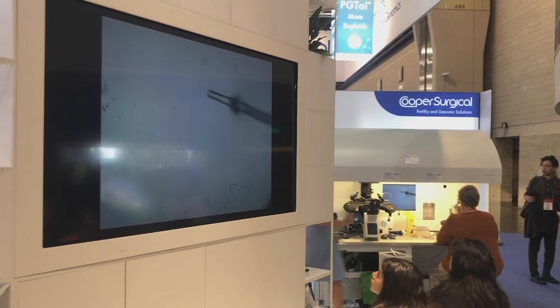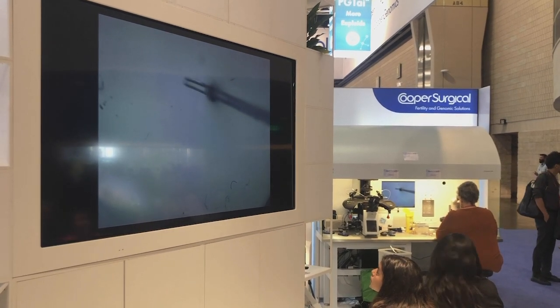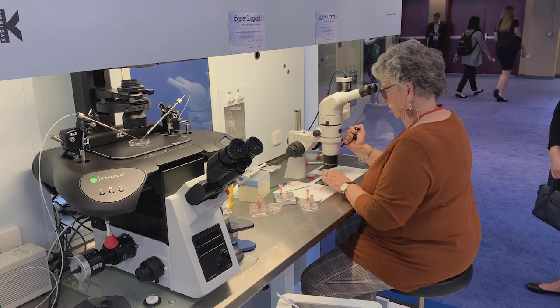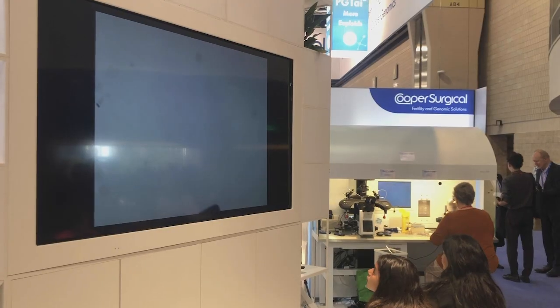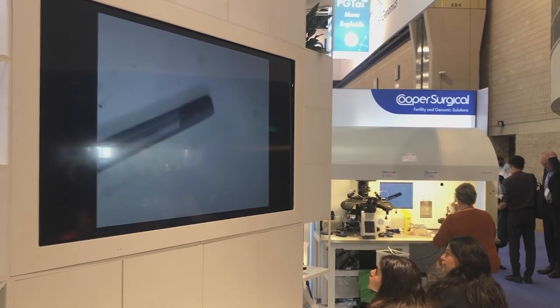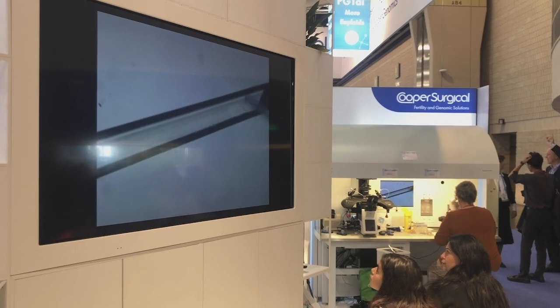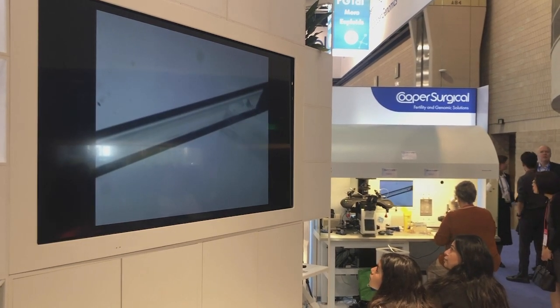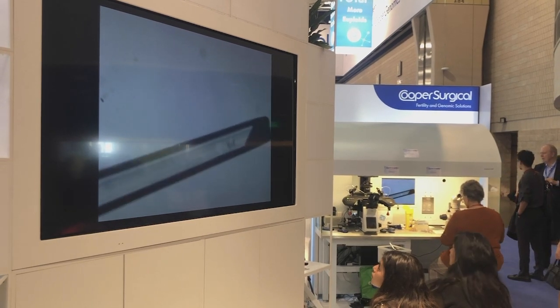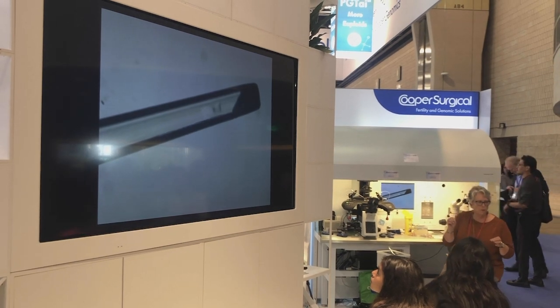So I'm just going to pull it up into the tip. I'm going to set it so I can see it, and so it's got the curve up. And then I'm going to come down, and I'm not really expelling much. There it is. It came right out. That drop is a little big because I had touched it with my pipette tip. So that's a little bigger than I would normally use.